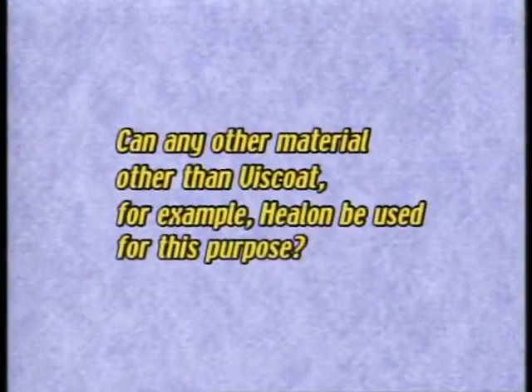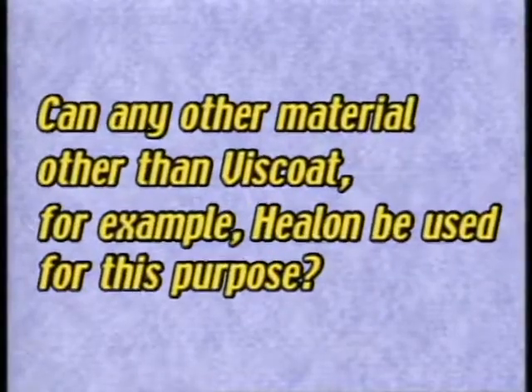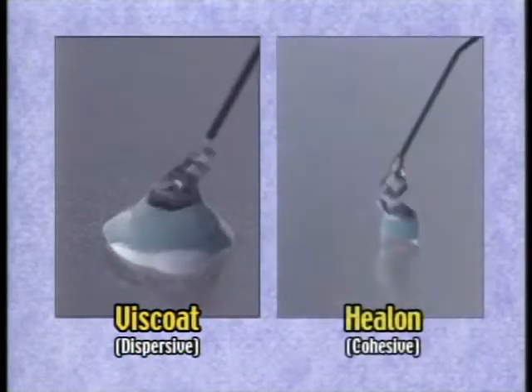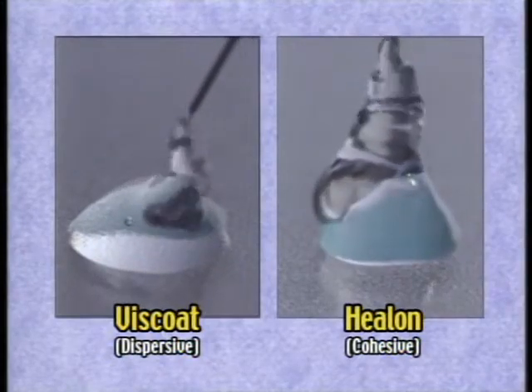Can any material other than viscote, for example helon, be used for this purpose? Viscote is dispersive, while helon is cohesive. When viscote is dropped, it will uniformly spread flat, while the dropped helon will not uniformly spread but remain in the dropped shape.